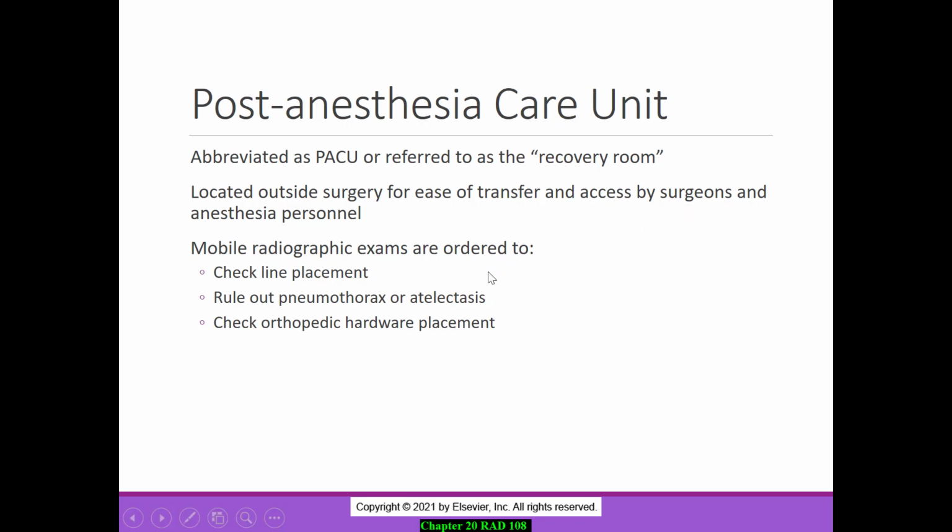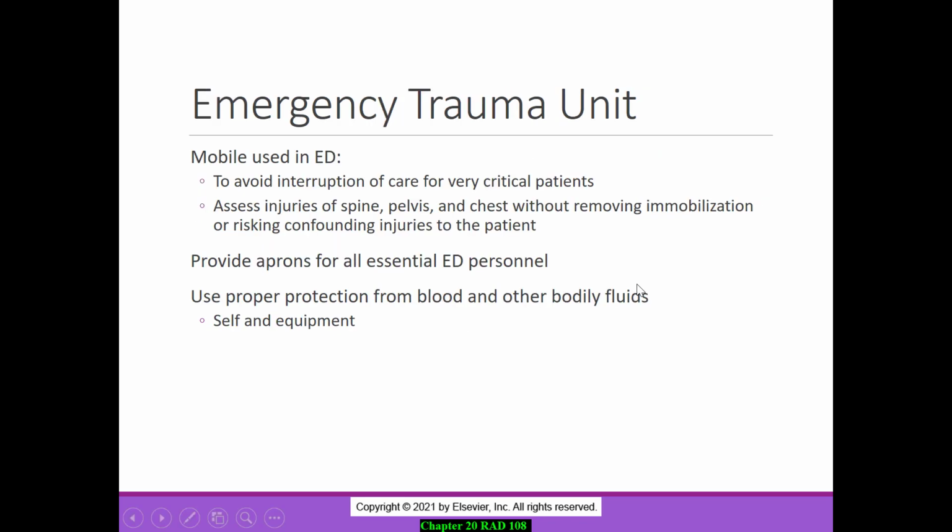You will get called up to PACU to do radiographs as well, so sometimes those will be check line placements. You may be doing chest radiographs up there as well, or if they've had some type of orthopedic surgery done, you'll be doing a check for the hardware placement to make sure nothing's moved or changed since they pulled them out of surgery. You have your emergency trauma units, which is your mobile used in the emergency department.